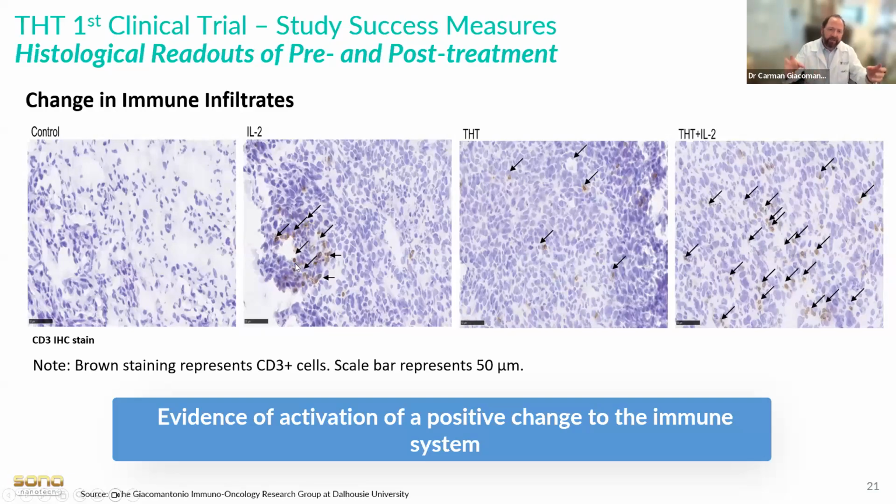And what you're seeing there is it's all clustered at the edge of the tumor. It actually doesn't penetrate into the tumor. So the tumor to the right is free of the effect that we're trying to achieve. And we see this in cancers very often in the human setting, that person on immunotherapy has immune cells at the edge of the tumor, but they're not getting in. And that's that tumor microenvironment. And that's why the tumor microenvironment is such a big focus of this device and this effort, to change that microenvironment to enable cells to infiltrate. Those cells with the arrows on the edge in panel 2 are literally knocking at the door.